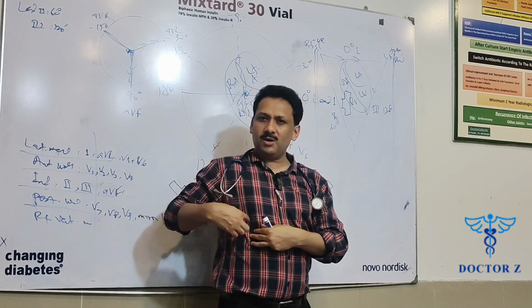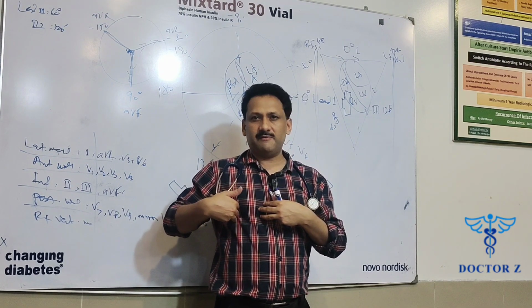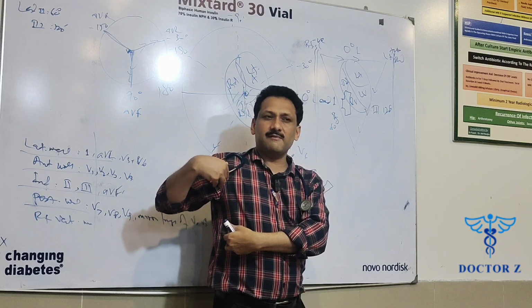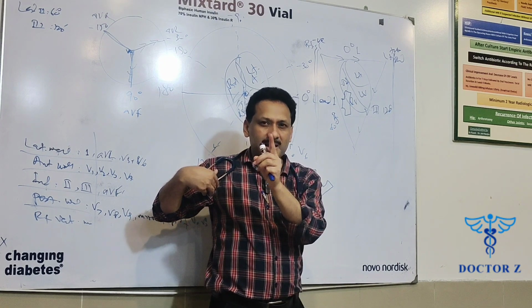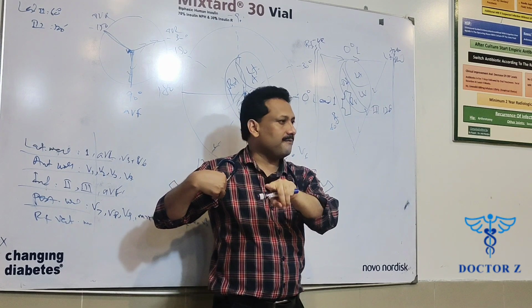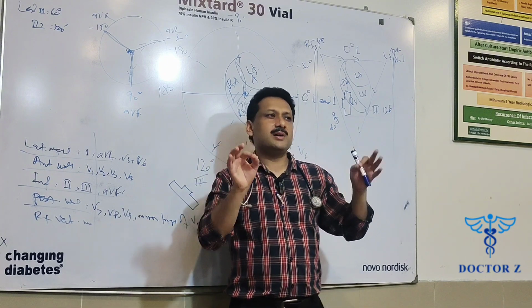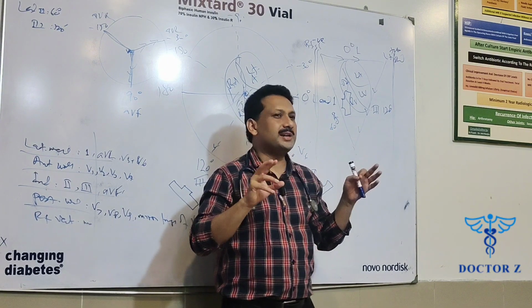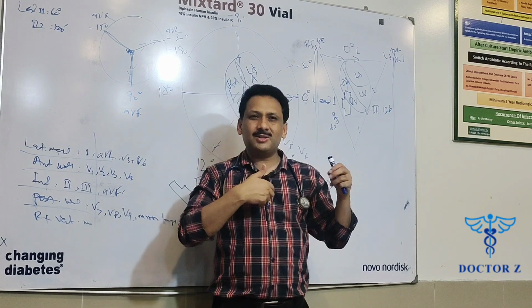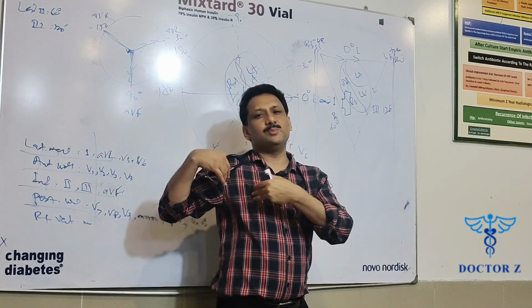V4 mid-clavicular line, V3 between V2 and V4, anterior axillary line V5, mid-axillary line V6. But I name them RV1, RV2, RV3, RV4, RV5 and RV6. Why? Because they have been placed on the right side. So if ever you do that ECG on the right side to see the changes in the right ventricular wall, let those V1, V2 stay as such, and the rest of the leads be placed like that.